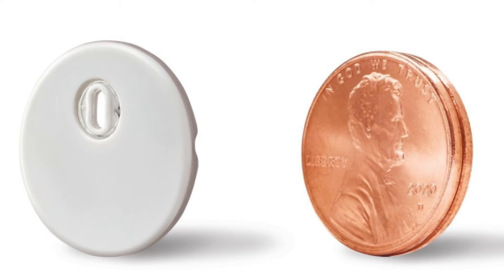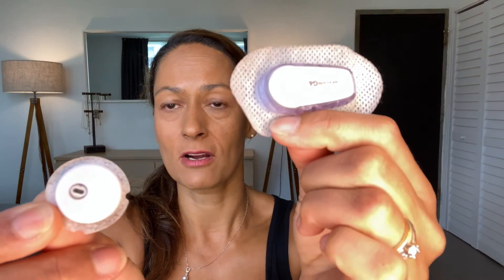The Freestyle Libre 3 is smaller — not just smaller than the Libre 2, it's actually smaller than any of the other CGMs available on the market right now. You can see here in comparison: this is Dexcom G6, and this is Libre 3. It's tiny. And Libre 3 is a real CGM — a continuous glucose monitor. It's no longer just a finger stick replacement, so you no longer have to scan your sensor to get your blood sugar readings.